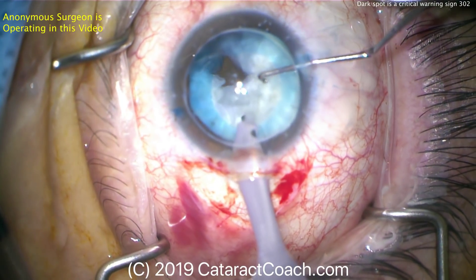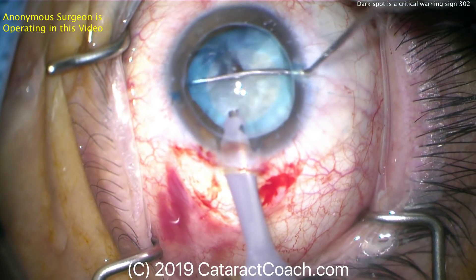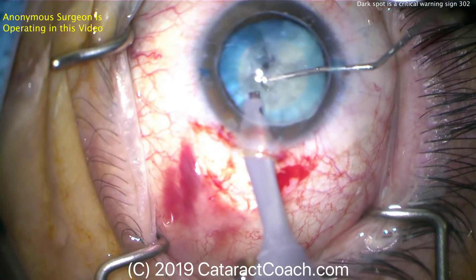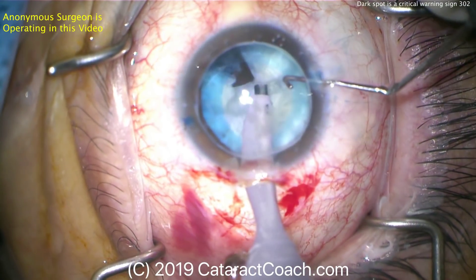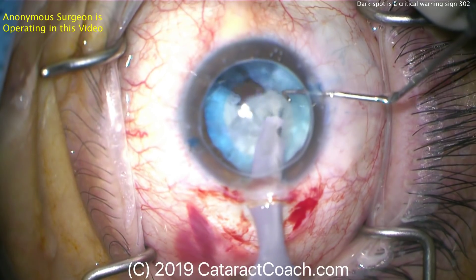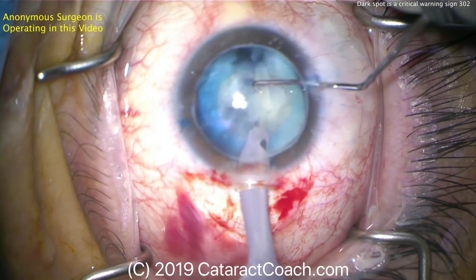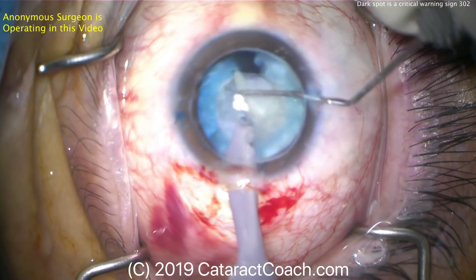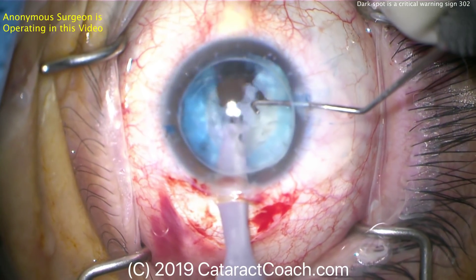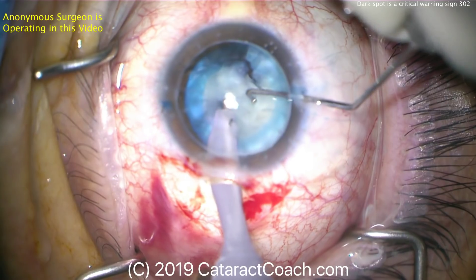Now it's even bigger — now we can tell the capsule is certainly wide open. The priority now has to be getting this lens material out of the capsular bag. Maybe inject some viscoelastic in that hole. Now it's a very big posterior capsule opening. Trying to get all this lens material out — there you were losing pieces left and right. Lots of pieces are going back into the vitreous cavity.